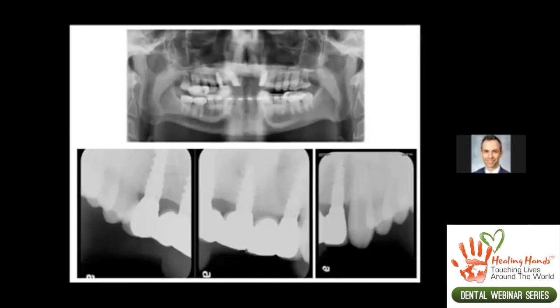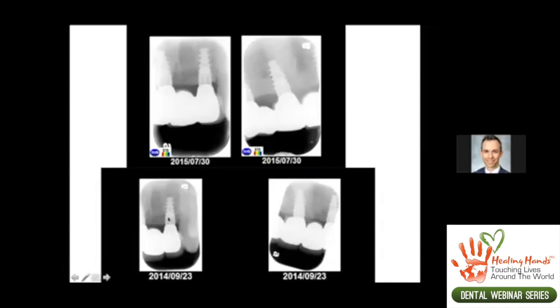And this patient ultimately had 3 implants placed, and you can see the orthodontic appliances. The orthodontics were used to open up his vertical dimension of occlusion as we were waiting for the bone graft to heal. And you can see the restorations in place. Actually, as I was preparing this presentation, I was looking at some of these x-rays that were sent to me by the restorative prosthodontist, and I want to criticize myself here a little bit because I didn't really give enough vertical clearance for these teeth.